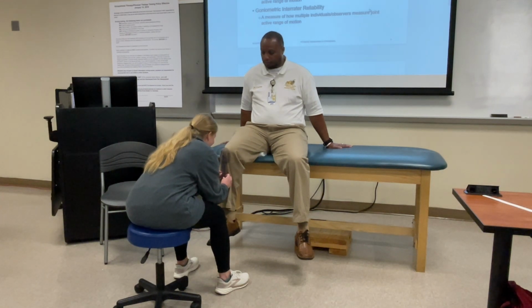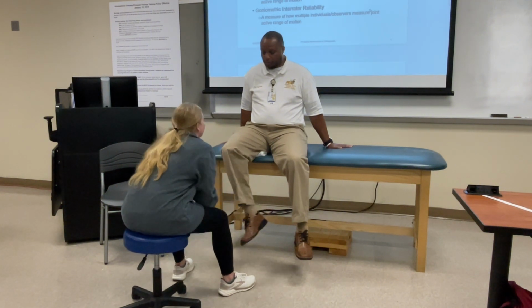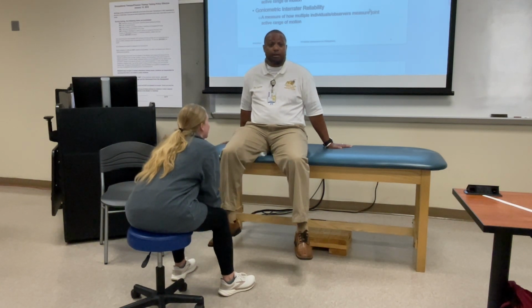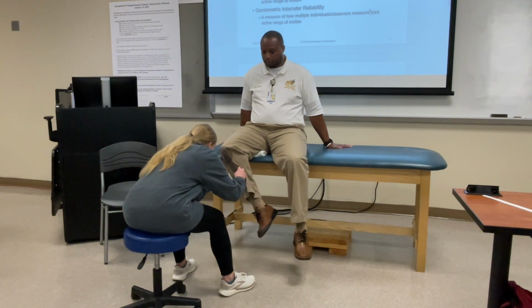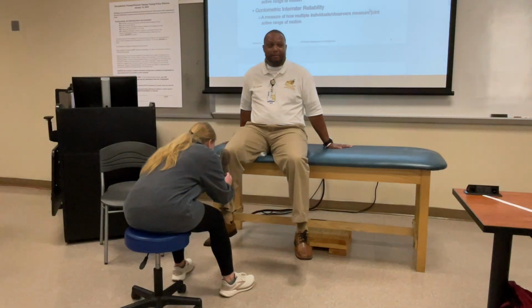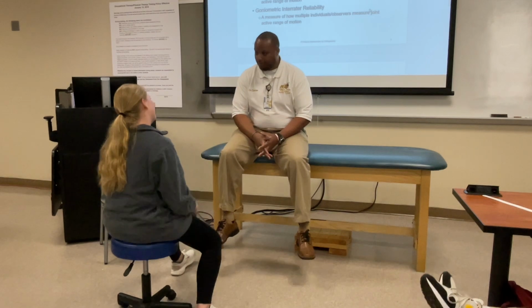Alright, now bring your leg in. I got 40. Okay, you got 40? Yeah. Is that correct? When she's taking her practical? 0 to 40. Okay. Alright, bring your leg in again. I got 40. 0 to 40. Okay, so you have it. We're creatures of habit. Alright, and bring your leg in again. I got 40. All right. 0 to 40.